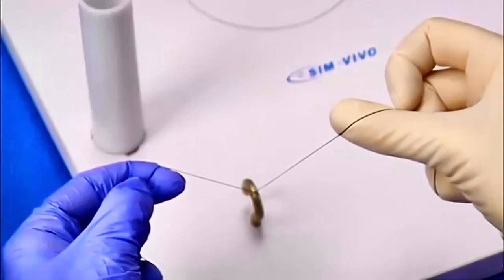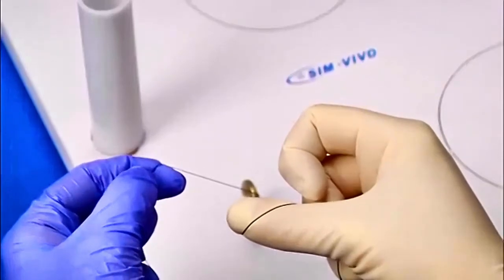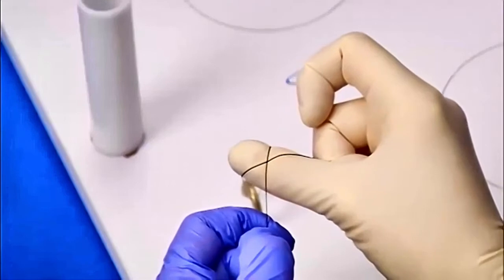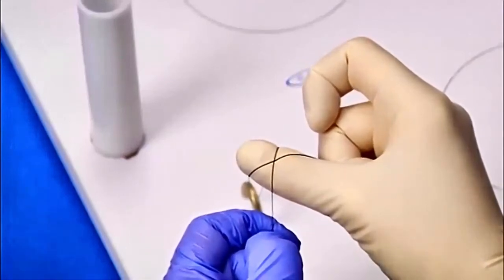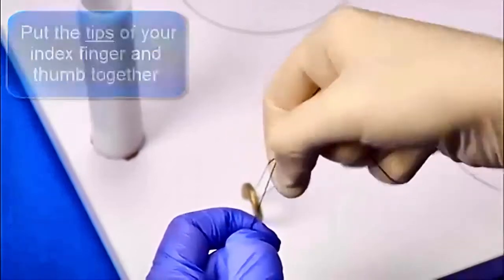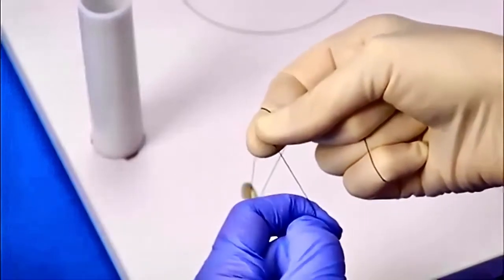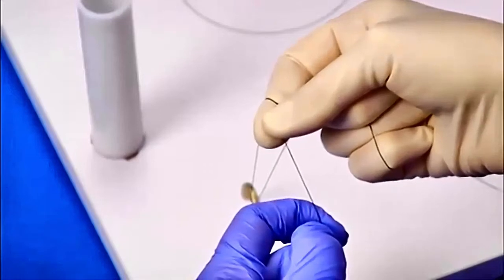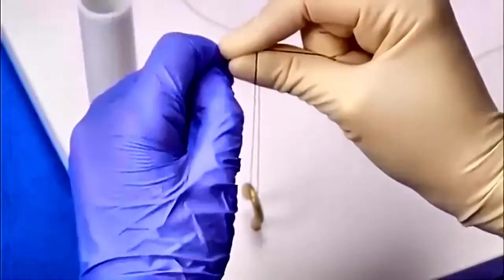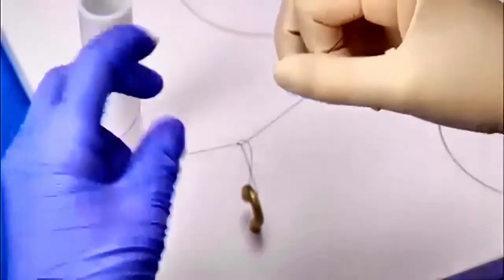To get started, hook your active thumb around the outside of the suture end in the active hand. Push it to the left, which will create one half of the loop. Wrap the suture in your passive hand around the medial aspect of the thumb, which will create a full loop. Now, oppose the tip of your index finger to your thumb and push your index finger through the loop using your thumb as a guide. With your passive hand, lay the free end of the suture over the index finger and secure it with your thumb. Push your thumb back through the loop and drag the suture through. Grab the loose end of the suture with your passive hand and take up the slack. You have just completed the first throw of a square knot.